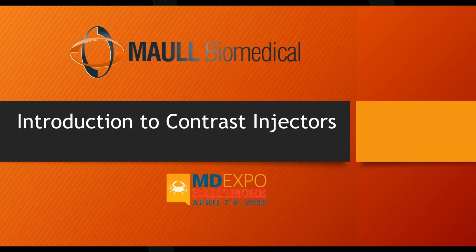So what we have to do is put something in the blood to make the blood absorb the radiation so that the blood vessels now show up on the X-ray image. And that's what that is, all right? That's a pump that, during the X-ray procedure, literally as we're firing radiation at the patient, we turn on, and we fire fluid into the patient's veins and arteries to fill them up while the radiation is striking them. So those veins and arteries absorb the radiation and show up as a nice bright area on the film. Okay, and the fluid that does that is called contrast.